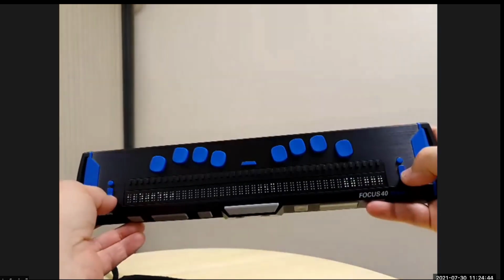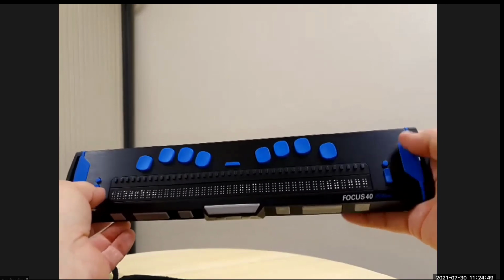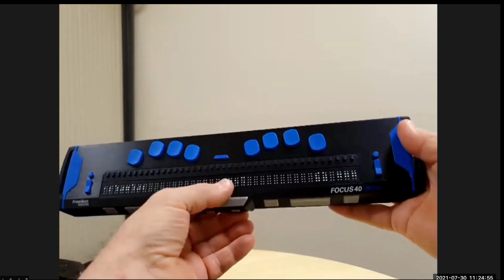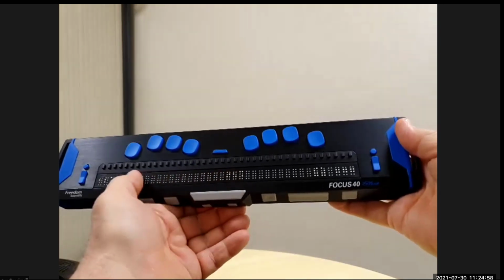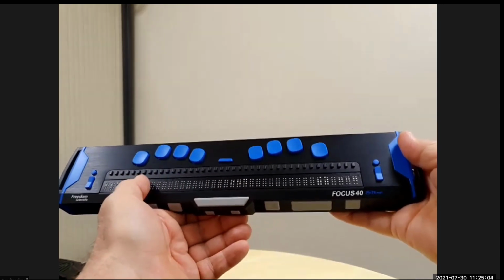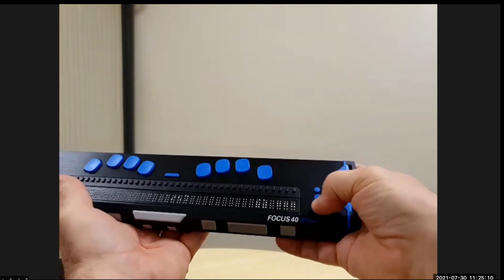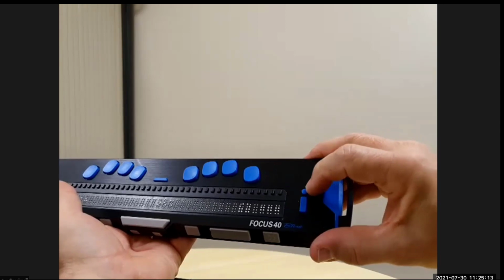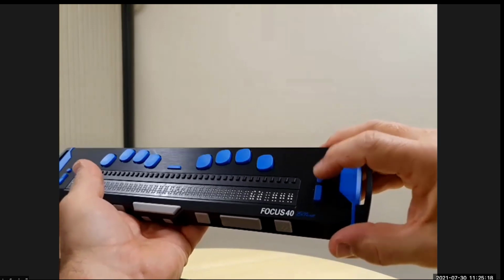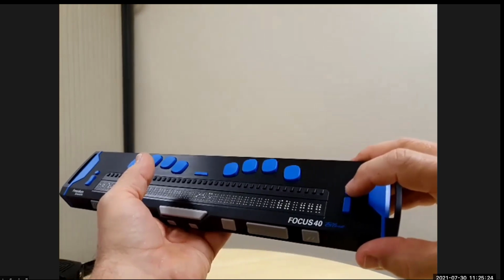So we'll have a look at the top surface. Starting from the front, in the middle, we have the space bar. And then behind that, we actually have our Braille. This thing's been ergonomically designed, and you'll see why shortly. So behind the space bar, we have our actual Braille cells. At either end of those, we have a rocker bar and a small round button. With the little rocker switch, you can press it either up, or you can press the bottom part of it to move down. And that does several things depending on where you are at the time, and we'll go through a couple of the functions of that.